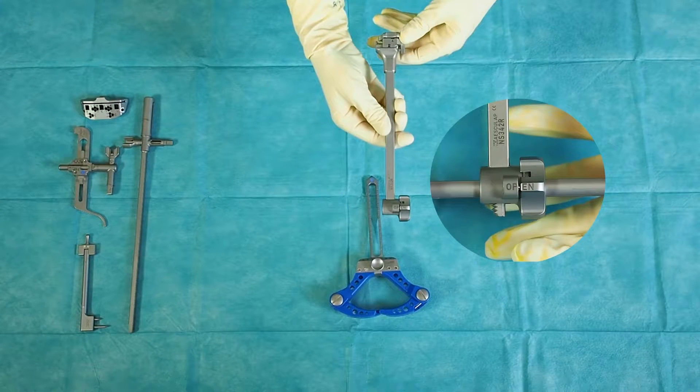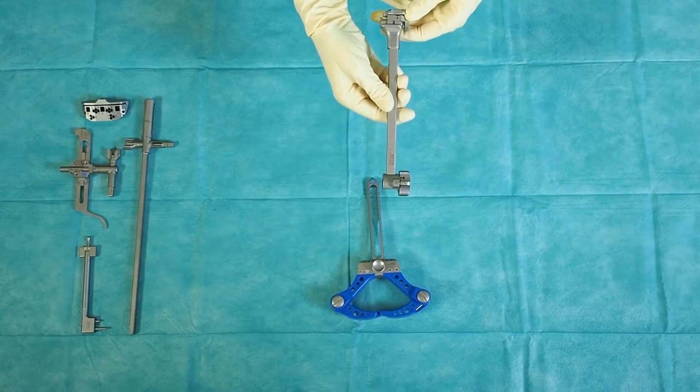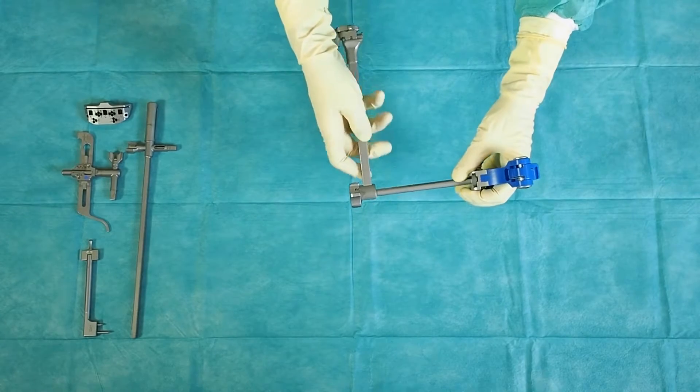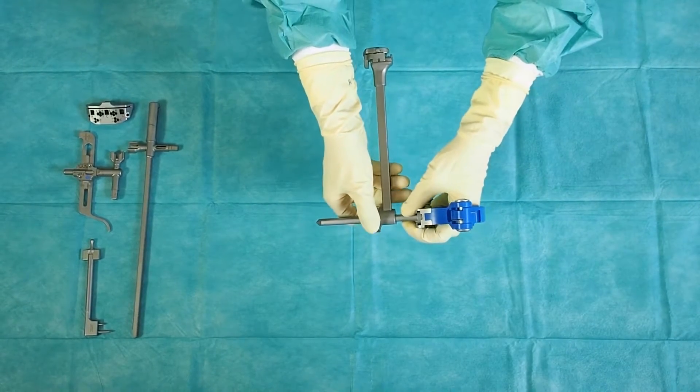Turn the wheel of the tibial alignment handle to the open position. Open will be displayed. Engage the handle onto the bimalleolar clamp and close the wheel.